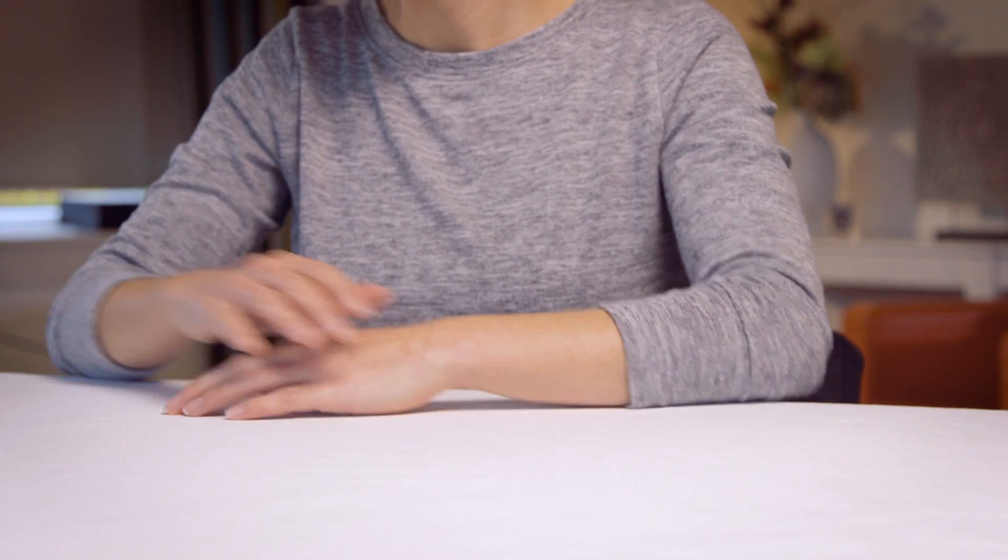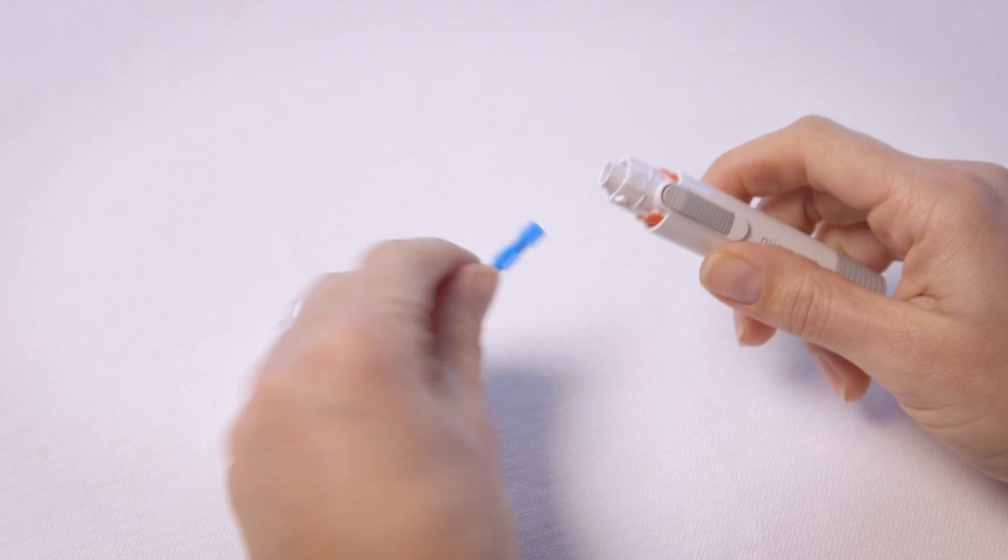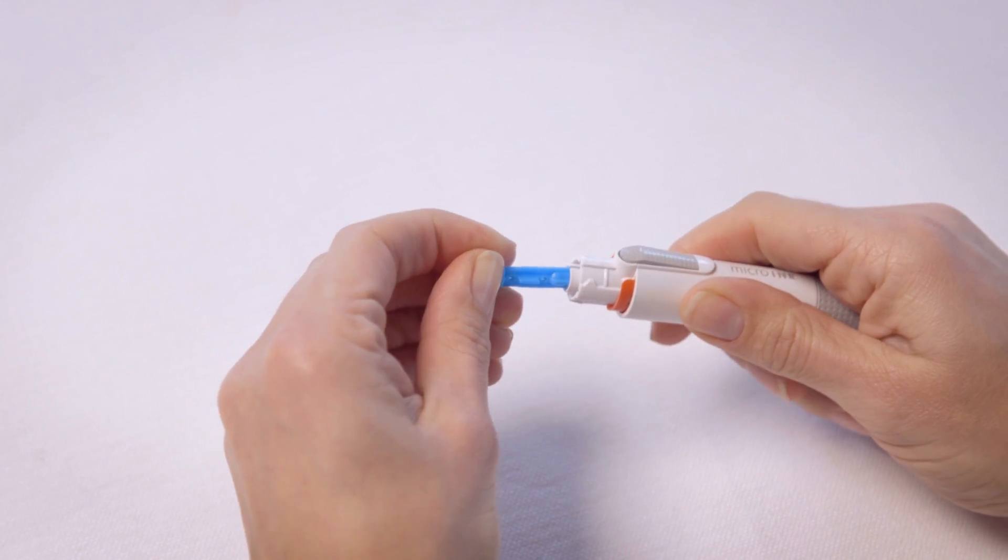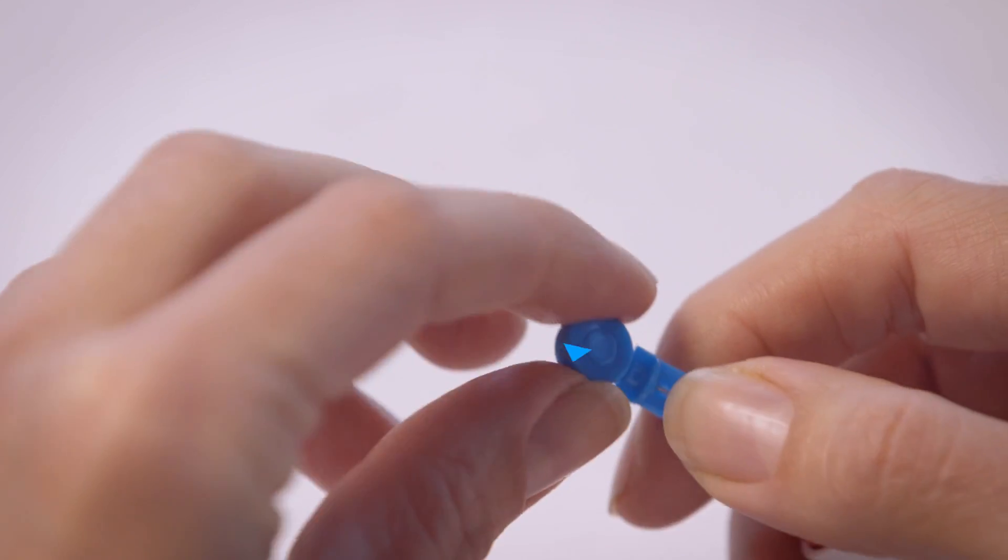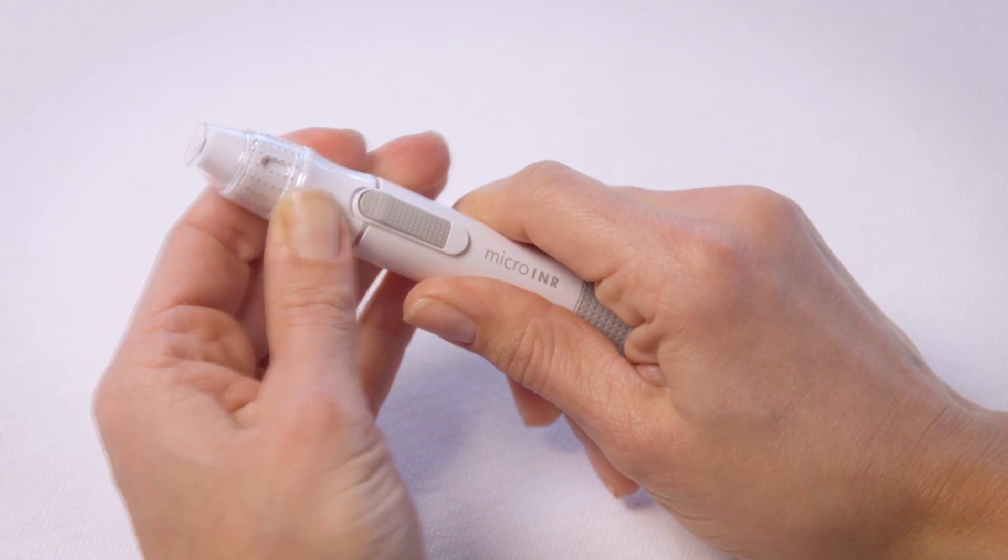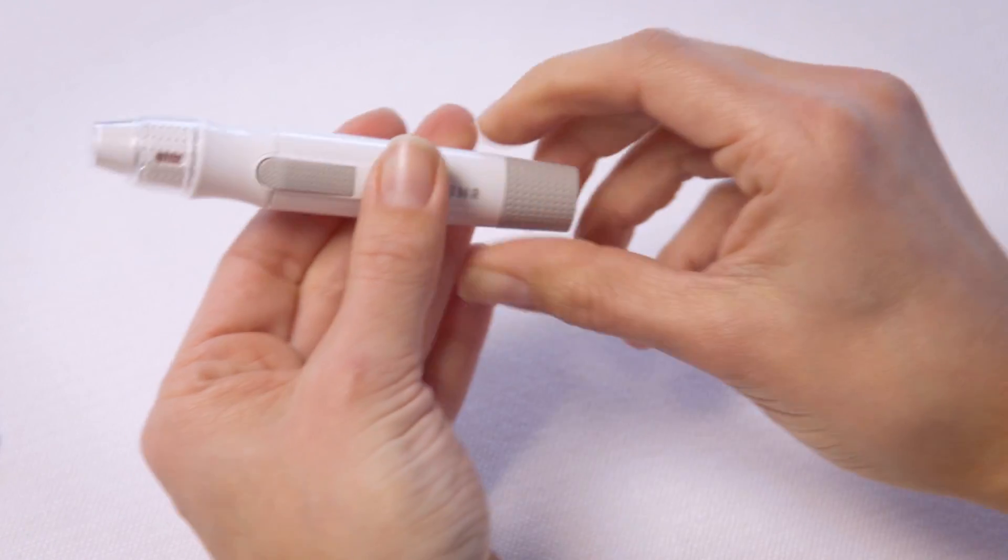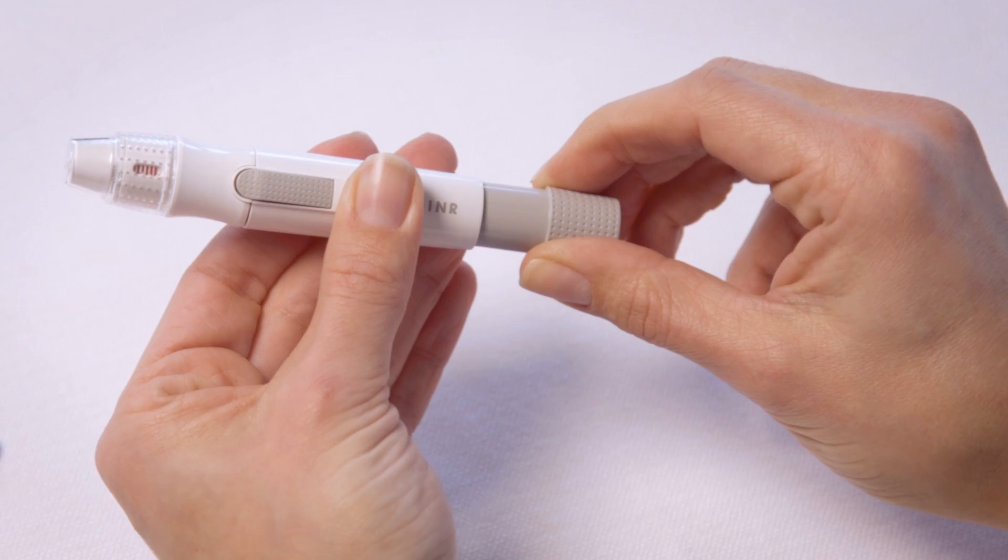Now we're going to prepare the lancing device. Remove the cap off the lancing device and insert the lancet. Remove the safety cap off the lancet with a rotation movement and place the cap back on the lancing device. Choose the right penetration depth and pull the plunger. The lancing device is now ready for use.